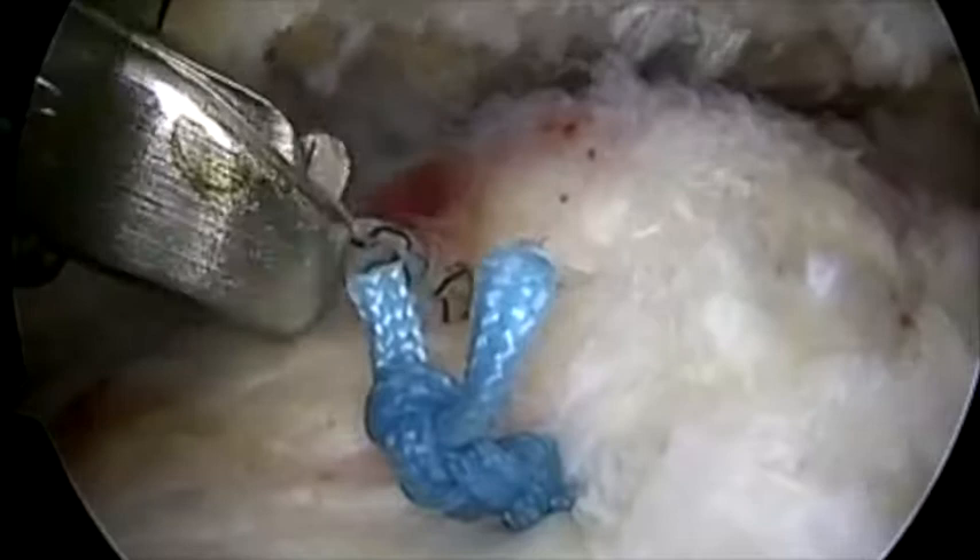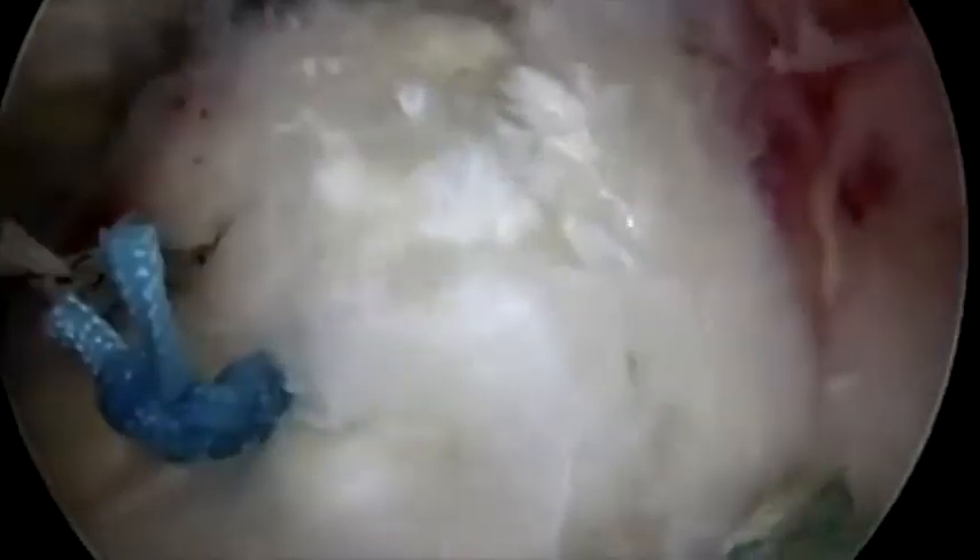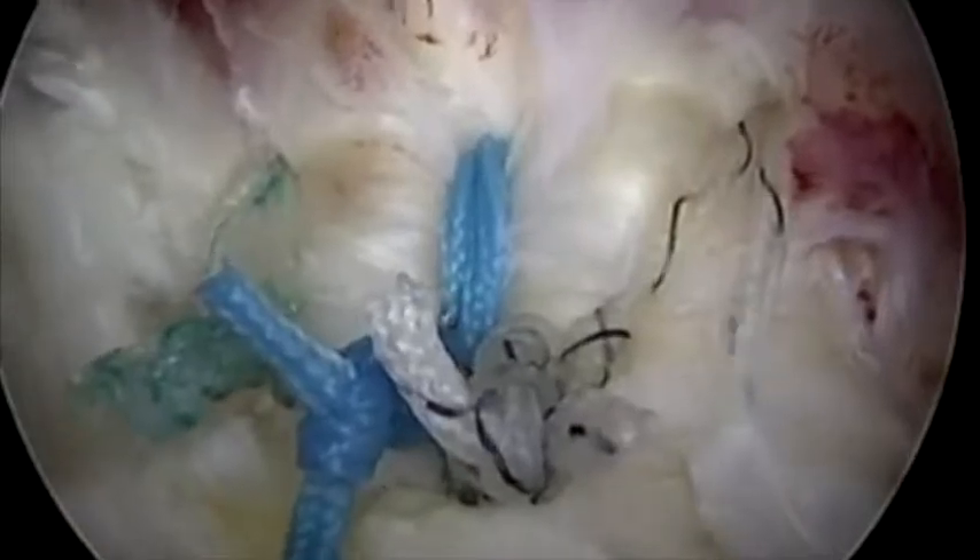When both sutures have been tied, knots are cut and the tear is then again inspected. A view from both portals confirms that the tear is well reduced. Internal and external rotation of the humeral head reveals that there is no evidence of impingement. Microfracture holes are then used to create small vents for marrow stimulation to encourage healing.